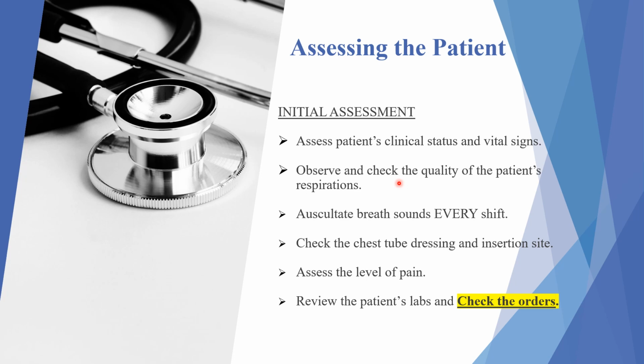We're also going to be assessing their level of pain. Remember, like I said, those tubes are big, they're uncomfortable. We want to make sure that we are assessing their level of pain and medicating them appropriately, right? Because we want them to re-expand their lungs. Patients with chest tubes have a tendency to breathe a little shallow. They're not deep breathing. They're not coughing, and they can develop atelectasis and other complications.